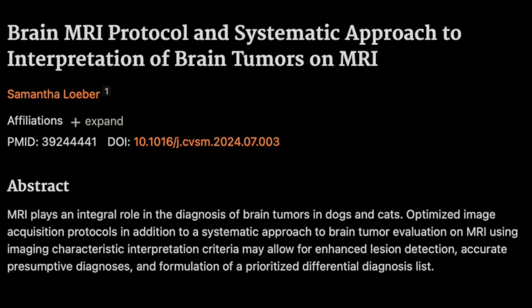Right, that was in the paper too. It's all about blood flow, if I'm remembering right. You got it. Perfusion imaging shows us how well blood is flowing through different areas of the brain. Really helpful for spotting where blood flow is reduced, which can be a sign of all sorts of neurological issues. Like a stroke, right. If there's a blockage, perfusion imaging would show us exactly where it is and how much it's affecting the blood flow around it.